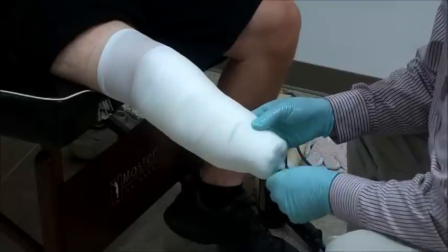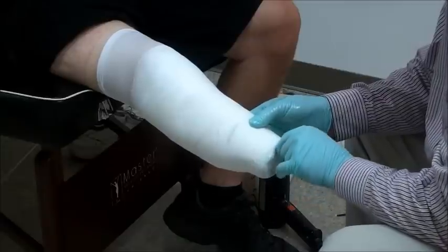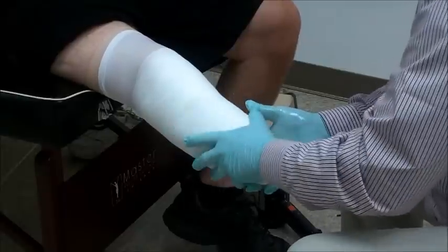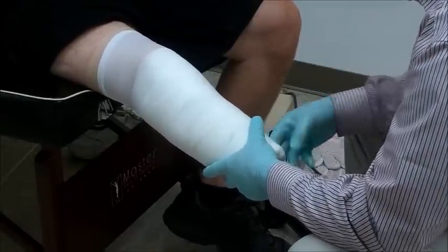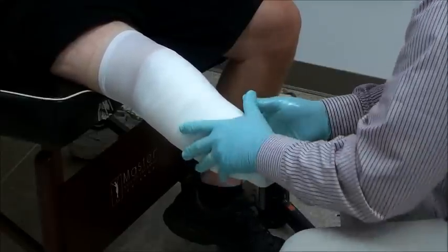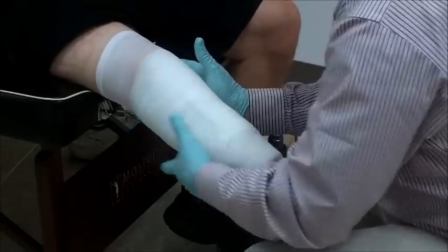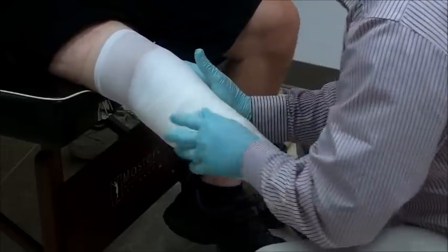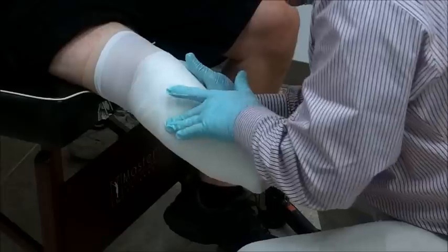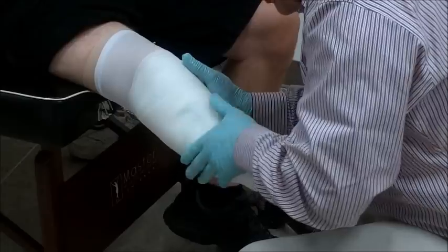If you want to take longer, use cold water. If you want to go faster, warm up the water. If you like it extra fast, put just a tad of hand soap in the water and it will make it go a lot faster. By using the dummy in my cast, I've ensured that I have exactly the right dimension for the MagLock and the liner connection, so I do not have any issue on spacing. On this cast, I'm going to load heavily on the medial tibial flare. I'm going to load the pre-tibials and a little bit around Gerdy's tubercle — I don't want to be on it.